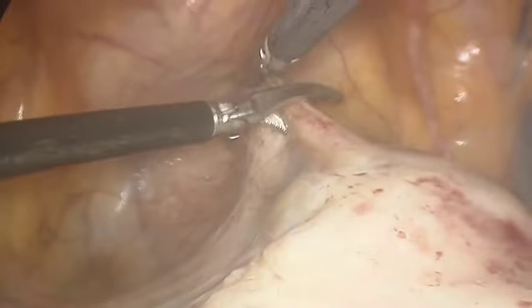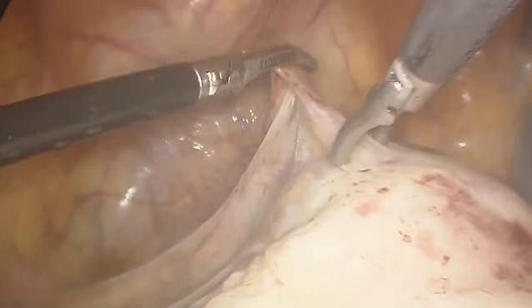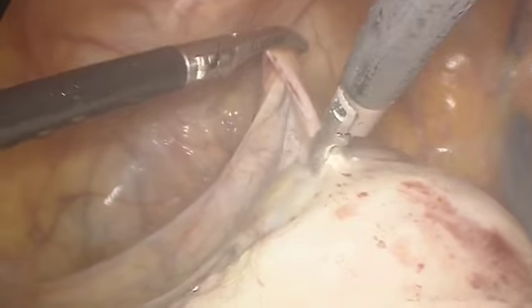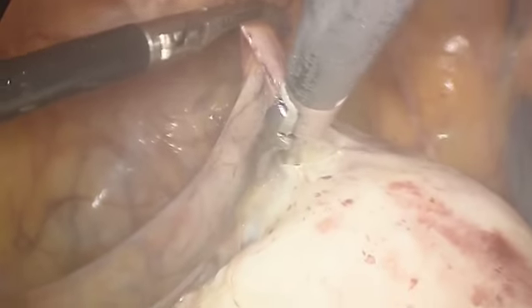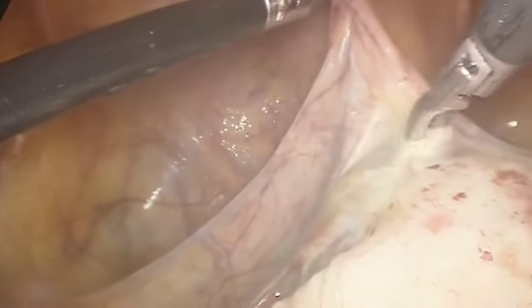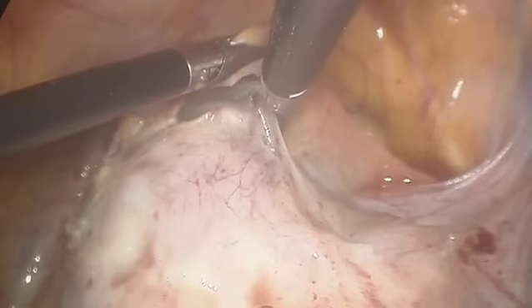Step 3. The bladder is carefully dissected off the lower uterine segment. Patience here is key. The pregnancy tissue is often densely adhered. Notice how the dissection stays close to the uterine wall, keeping the bladder safe. Alongside, the uterine vessels are identified, giving us the option of securing them quickly in case bleeding becomes difficult to control.